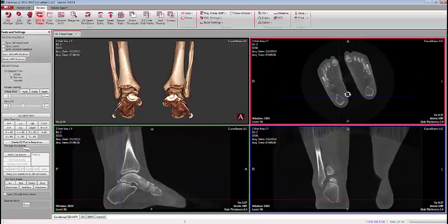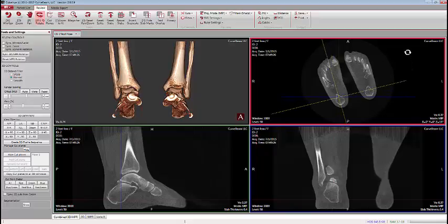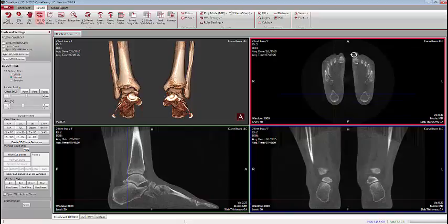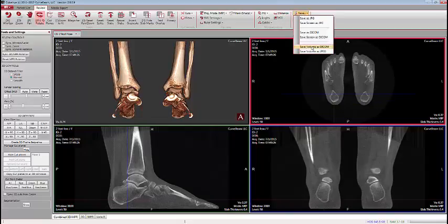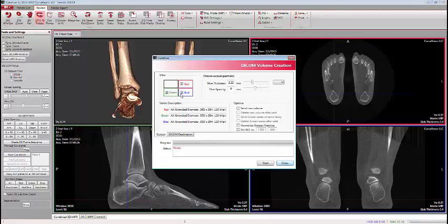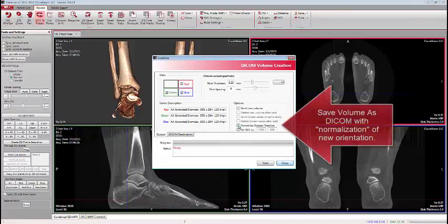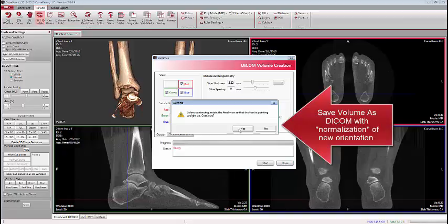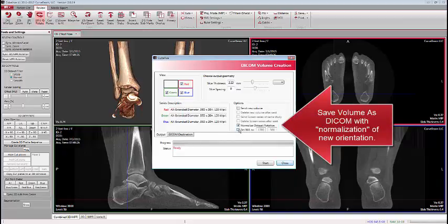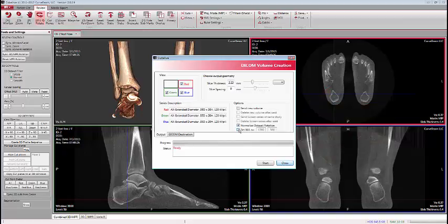Sometimes when we scan a patient, we find that the feet may not be correctly oriented to give us the correct viewing angle in our reformats or slices sent out to a PACS. After we make the correction to bring everything back into proper orientation, we can save the volume as DICOM, select the plane we want, then select Normalize Data Set Rotation. This will send out a new volume where the corrected orientation — with the toes pointing straight up — is now the default orientation for that data set.